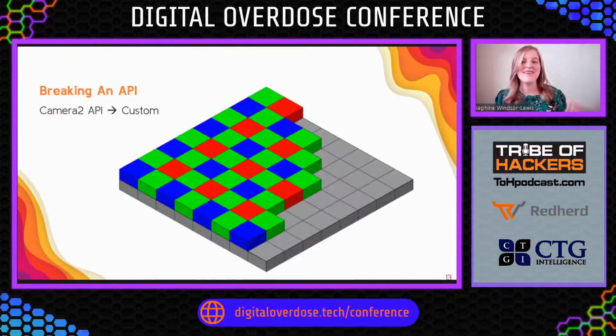It sounds a bit confusing, let me break it down. This is what the inside of your camera looks like. Not exactly, technically this is a scientific representation of the process, but that is nearly as exciting. It's a Bayer matrix. It is a series of light sensors, blue, green, and red, laid out in a grid. Four of these together, a little square, forms a pixel. That's the basic component of an image. It's an average of the blue, green, and red color readings.